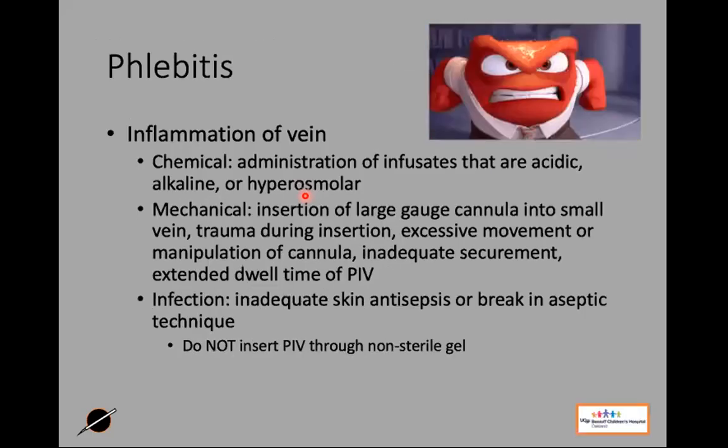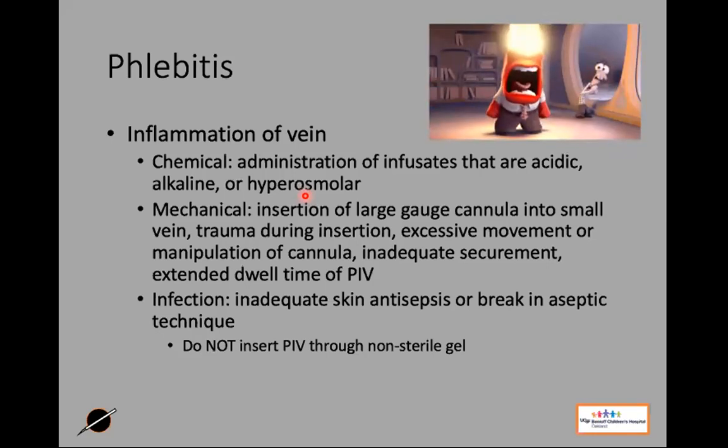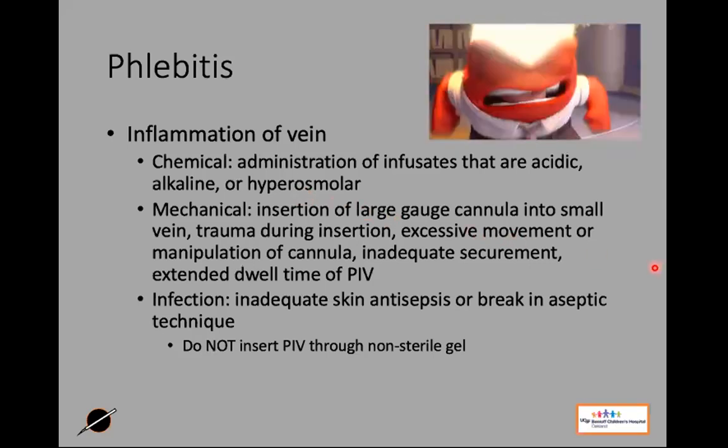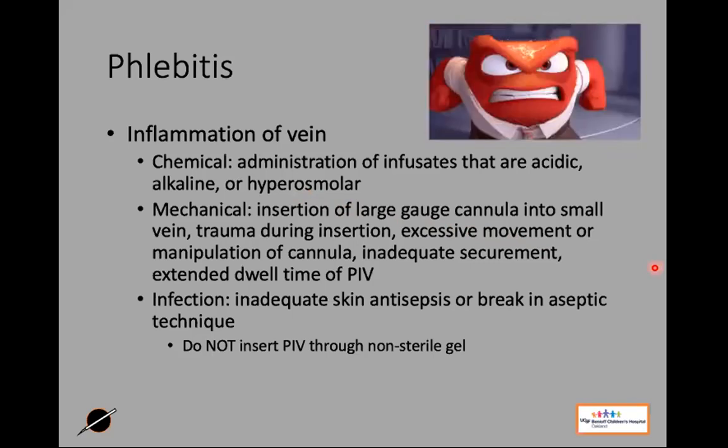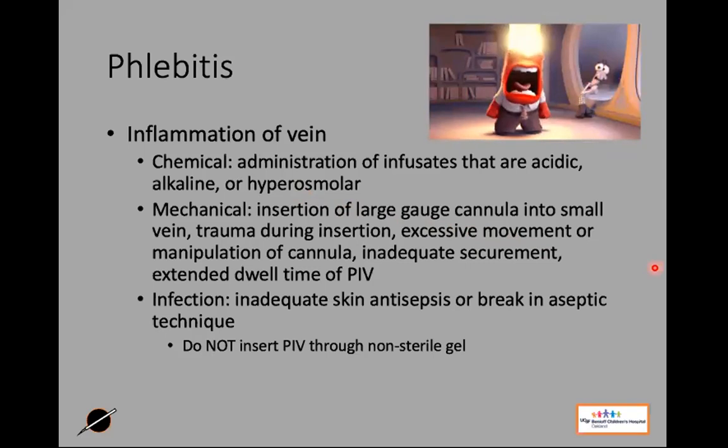Phlebitis, angry vein. Okay, again, anytime we talk about IVs, we're going to talk about some of the basics. We want to pay attention after we put it in. We want to think about what we're inserting through that catheter. Is it going to be an irritant? And assessing that over time.